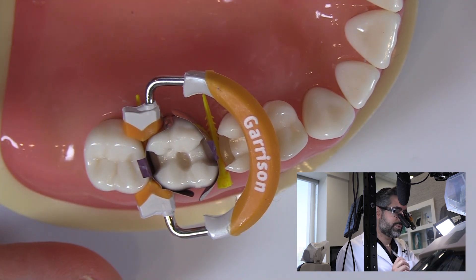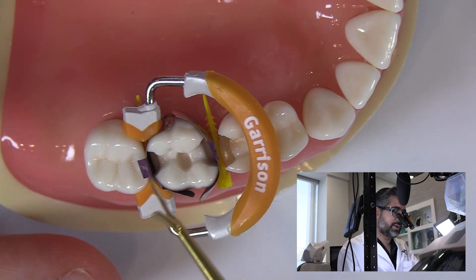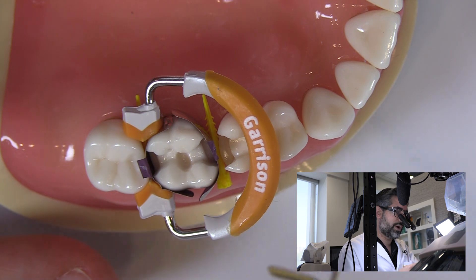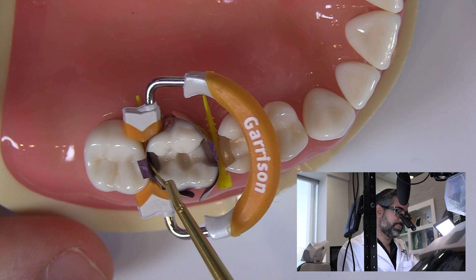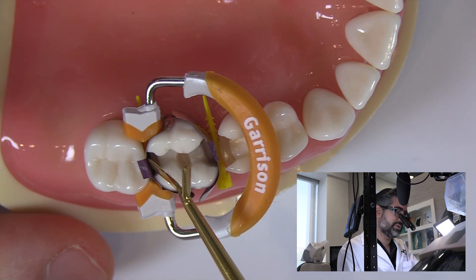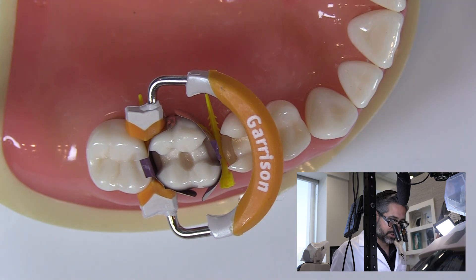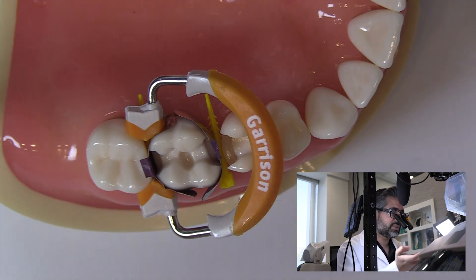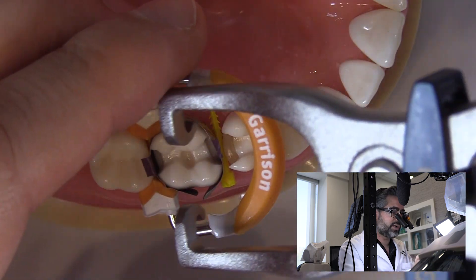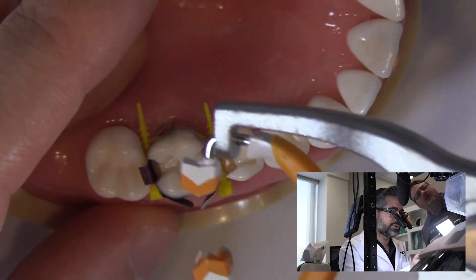Let's say we've restored this contact. I've already done my dentin bonding agent — my etch, prime, bond, or prime and bond, depending on what system you're using — and I already have that all down. First, I would fill up this wall and basically build up this distal contour. Then I would move this matrix band to the other side and build up that wall as well. Then I finish the central portion doing cusp by cusp, so I get a nice anatomy and a good final result.